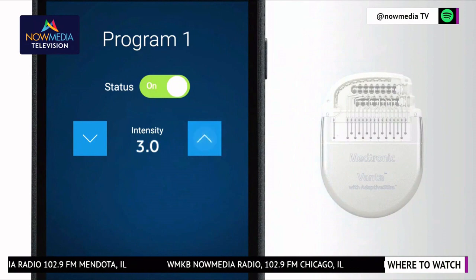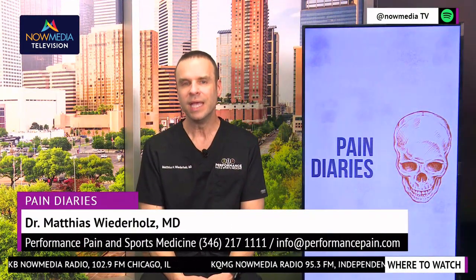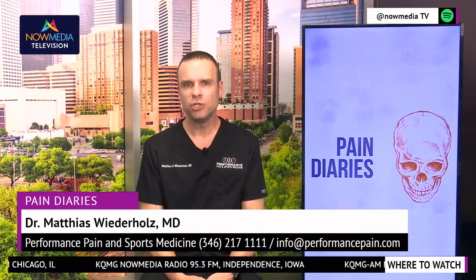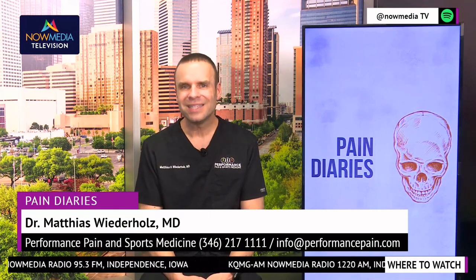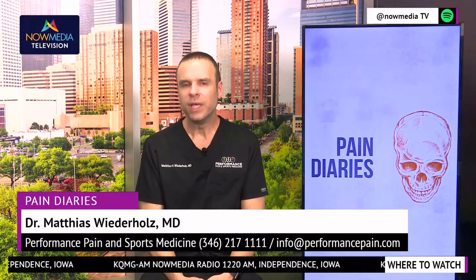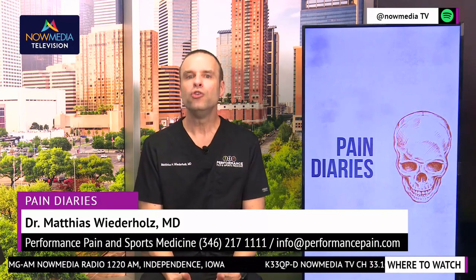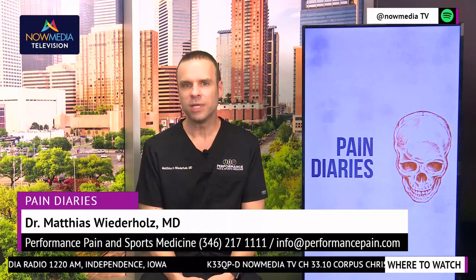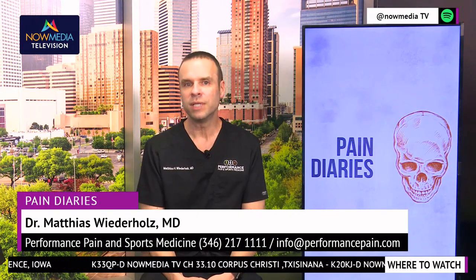And they're saying that 95% of that battery capacity will remain out at 9 years, and it's warranted for that amount of time. When the time comes that the battery needs to be replaced, that's an outpatient procedure, can basically be done under a local anesthetic, maybe a light sedation, and it takes about 15 minutes to replace a battery. Usually, if the battery lasts you 9 or plus years, there's a new battery that has already been developed, and you're going to be upgraded to the newer technology every time a new battery comes out.